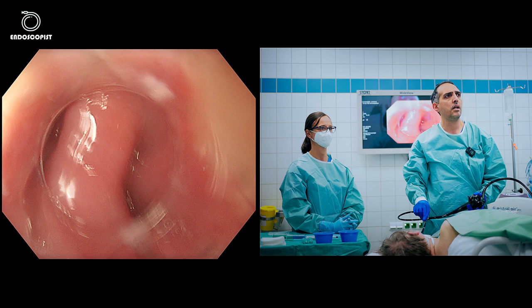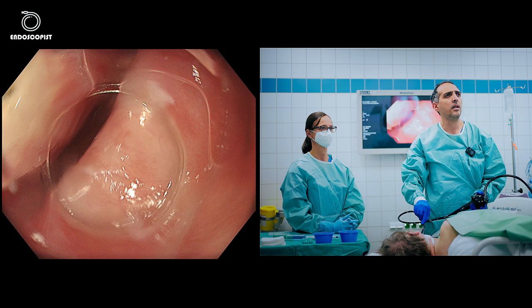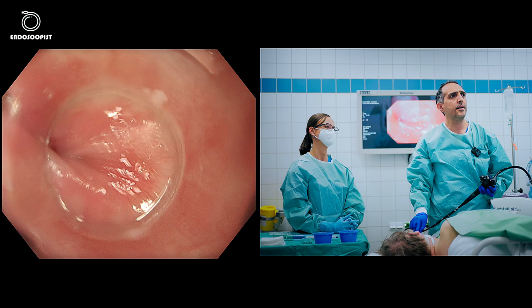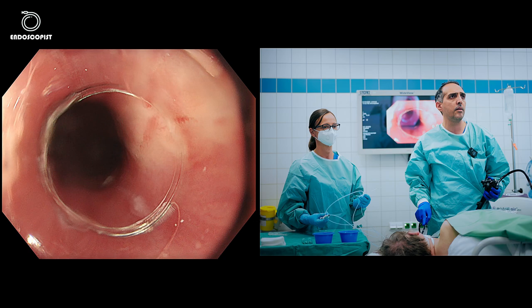Here is the septum of the cricopharyngeal muscle. In almost all cases of Zenker's diverticulum, there is a spasm in the upper esophageal sphincter which over time leads to formation of this diverticulum. Our assistant today is Miss Andrea, who has great experience with third-space endoscopy, having performed hundreds of ESD, POEM, and Zenker's diverticulum procedures. We're glad to have her.